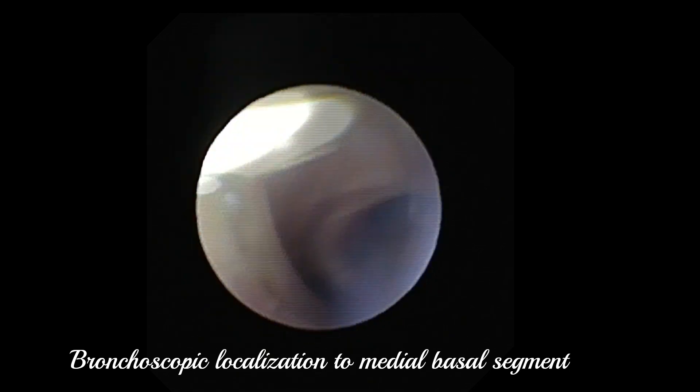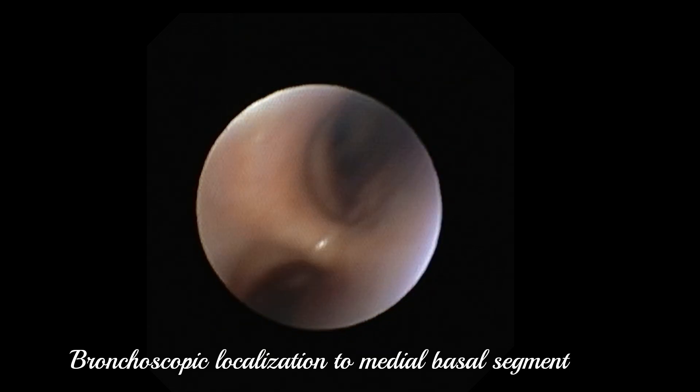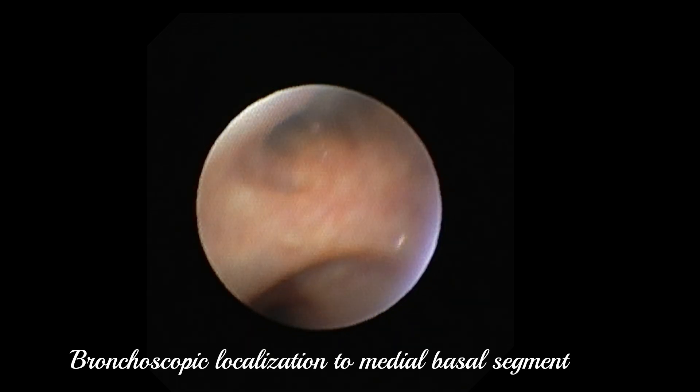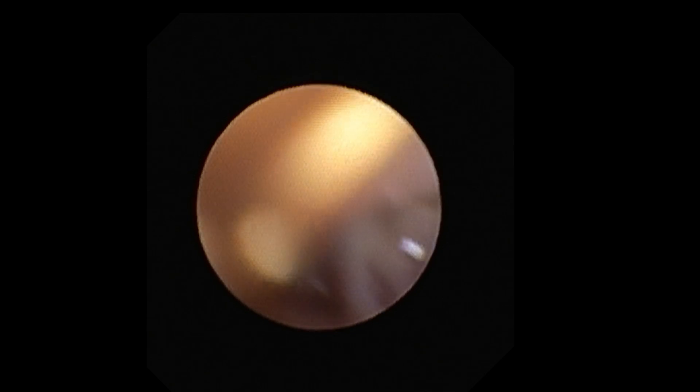Endoscopy showed the esophageal end of the fistula beneath the OVESCO clip. The bronchoscopic end of the fistula was localized in the medial basal segment of the right lower lobe under C-arm guidance, and confirmed with methylene blue instillation from the esophageal end, which was visualized in the bronchial tree.